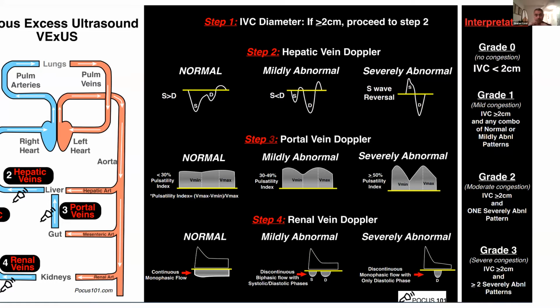the kidney, the liver. And as the kidney or the liver gets swollen, there's a capsule around it. So there's only a limited amount of expansion that the actual kidney or the liver can do. And so that will cause compression of the veins and arterialization of it. And so you'll start getting pulsatility as the liver gets more engorged and swollen. As there's more swelling, you'll eventually get to this greater than 50% pulsatility. When it gets really severe, it can get biphasic actually.